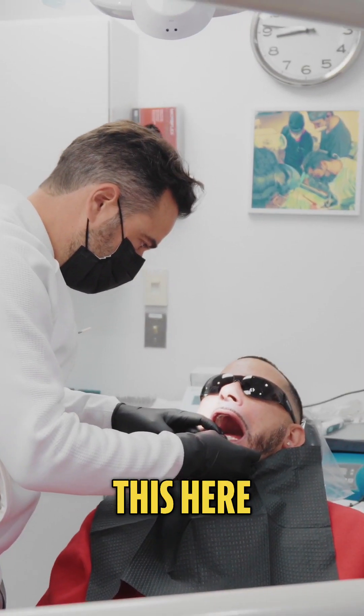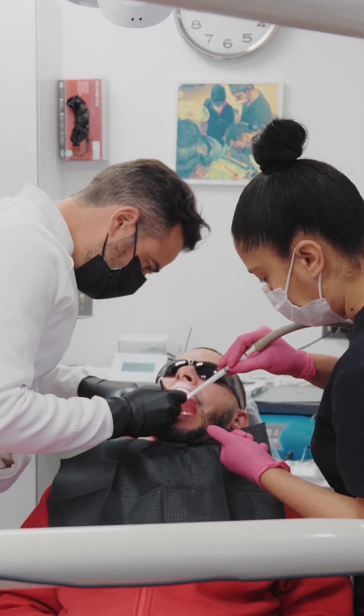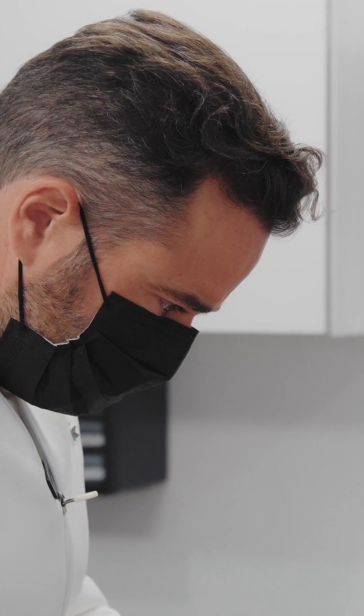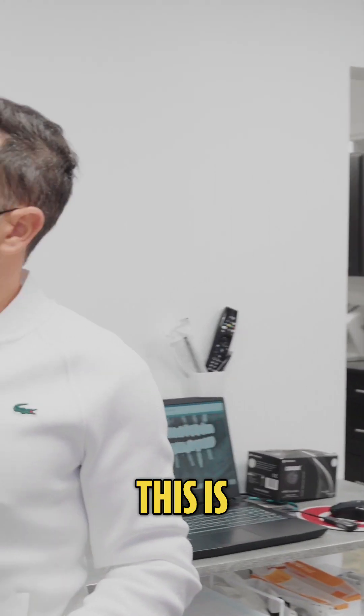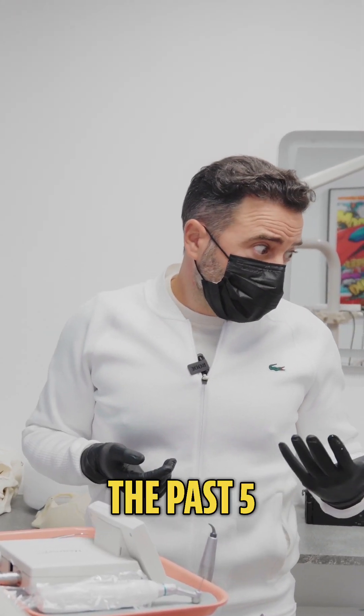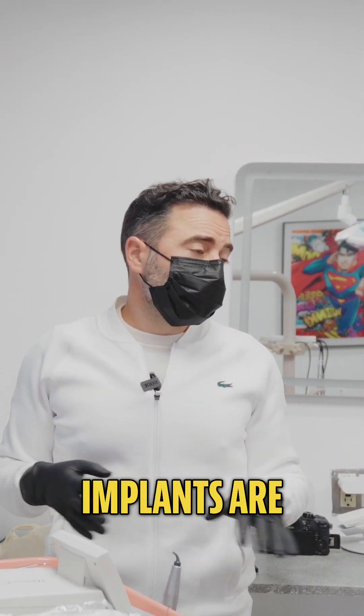This bone is also loose here. This is today's x-ray. You essentially have not lost any bone over the past five years, which is excellent, so your implants are under control.